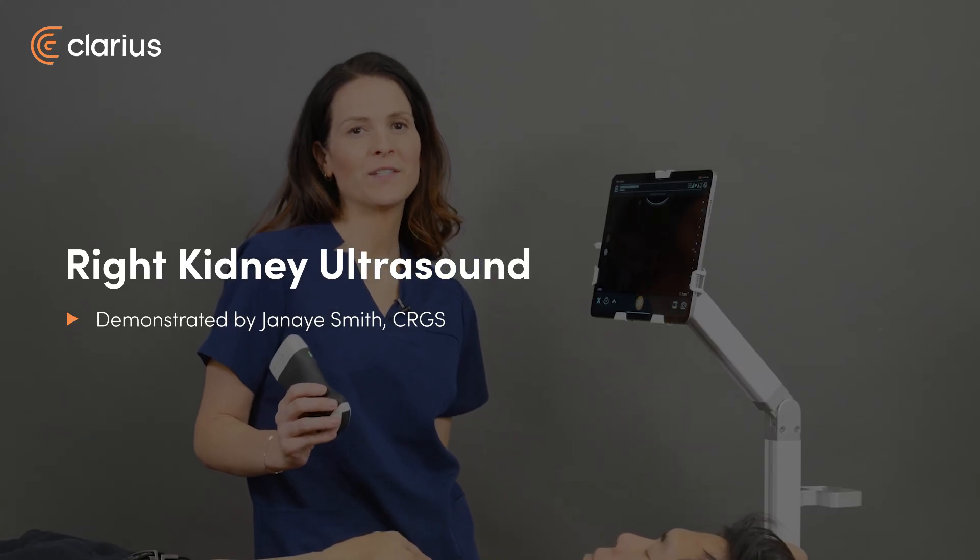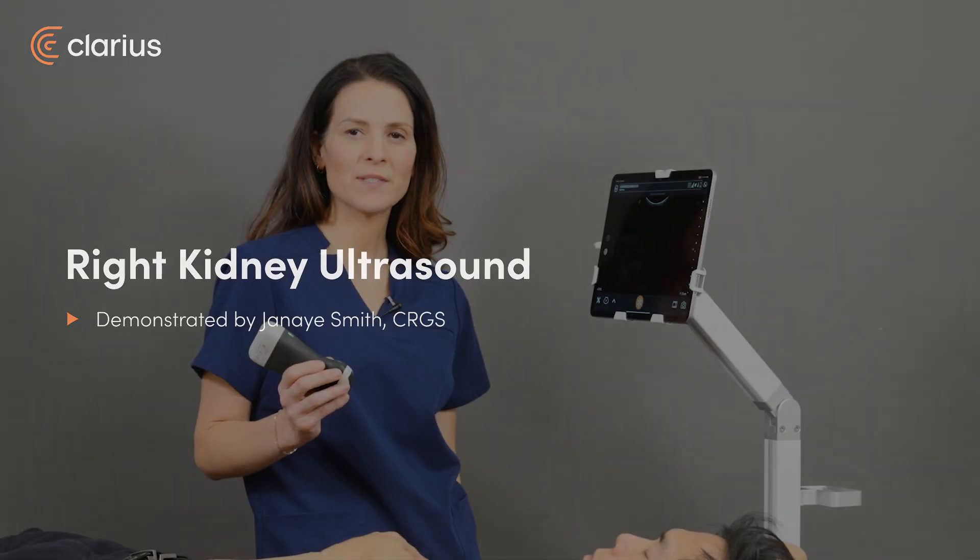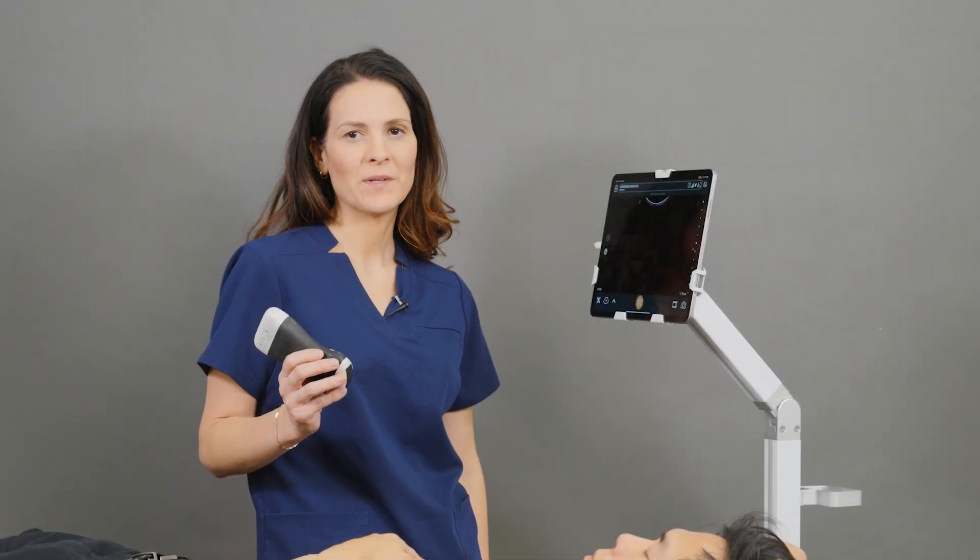Hi, I'm Janae. Today I'm going to be doing a demonstration of how to scan the right kidney. I'm going to be using the C3 scanner and the abdomen preset.